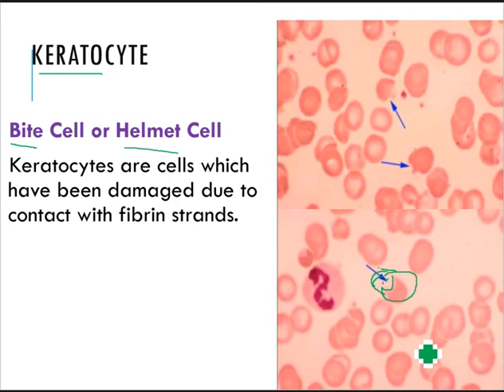But basically, guys, there are a lot of poikilocytes and you are going to remember and know them when you reach third year. So it's good that as early as now you have already touched on this topic.